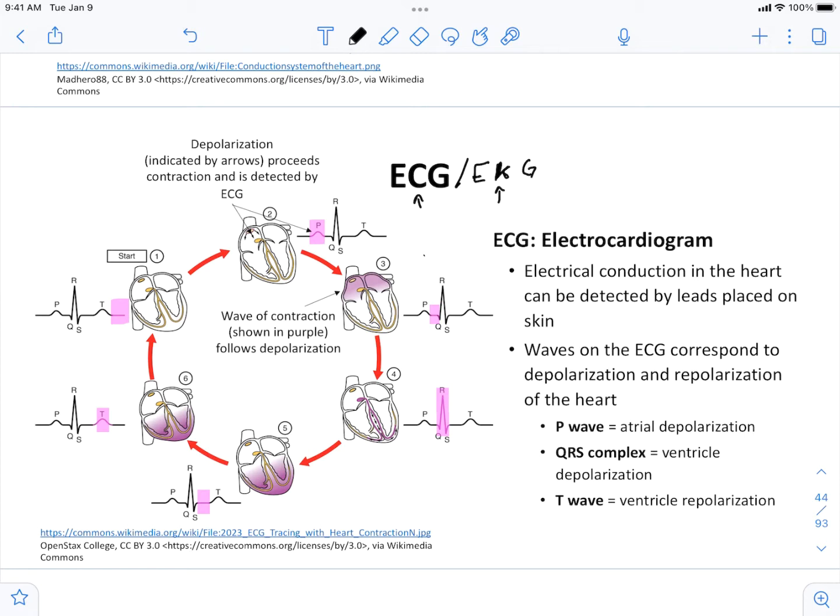It is important, of course, when you do an ECG that you're lying still. Anybody who's had this done in a hospital setting or at a doctor's office will know that you're asked to lie calmly on the table and relax, so that's an important thing to recognize. And the reason for that is if you're wiggly, the skeletal muscles will contribute to the overall electrical picture and will make it more difficult to read what's going on in the heart.